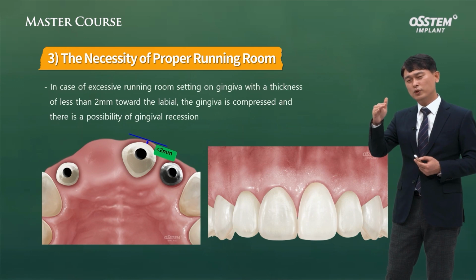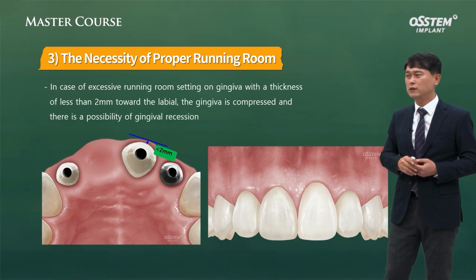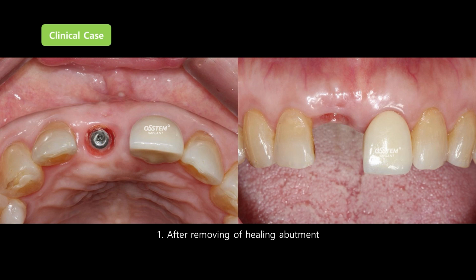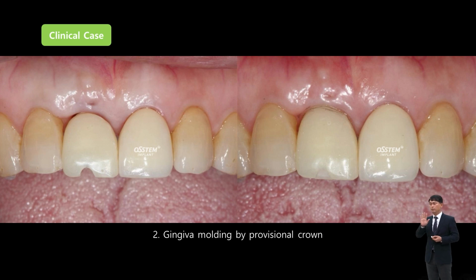Intentionally for this, I move palatally so that the buccal side has thicker tissue. Based on proper diagnosis, you can consider that after the healing abutment is removed, it begins to shrink. When a temporary is used for gingiva molding, resin can be accumulated little by little to push out the gingiva.